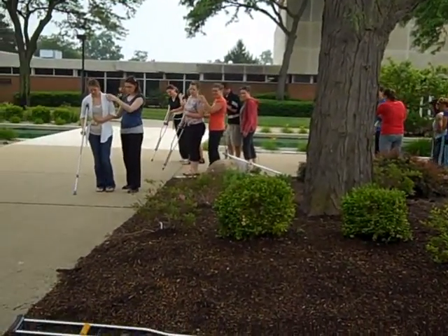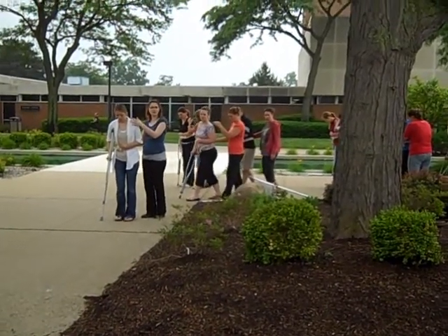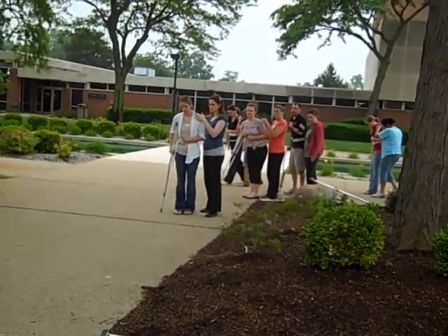Which hand is going to be your hover hand, therapist? Your left hand should be your hover hand.